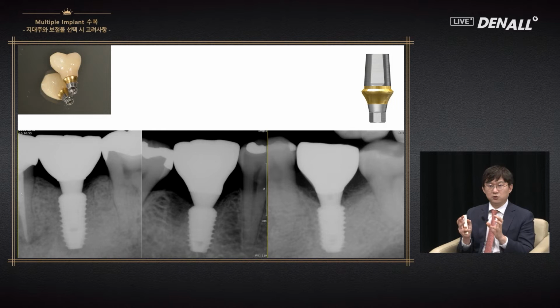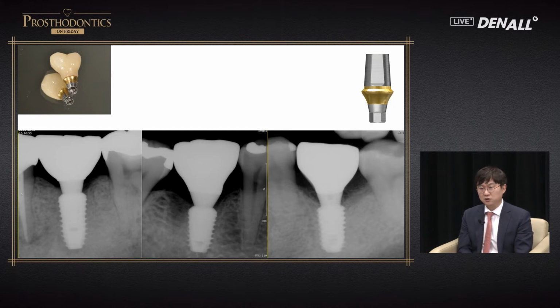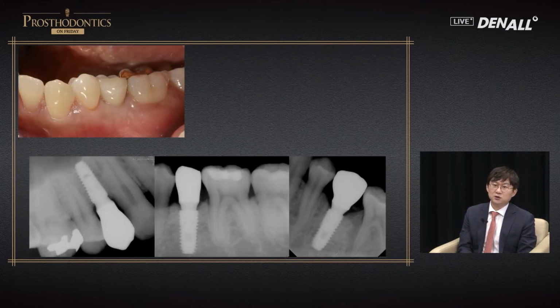There's no problem aesthetically. When the abutment is thin at the starting point, it has less interference with the bone. The soft tissue will become thick surrounding that area.